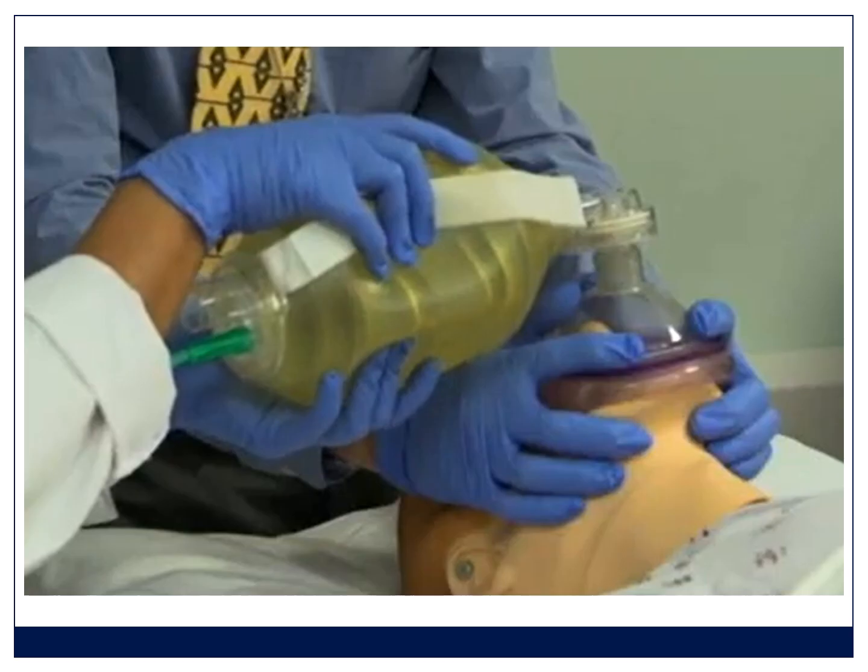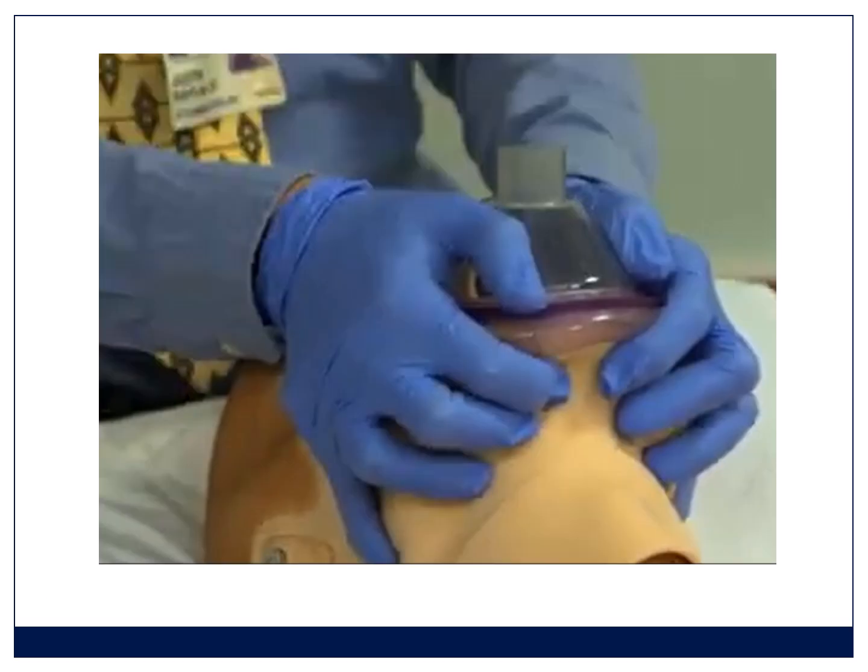Now, difficult mask ventilation by definition needs 2 operators. So the one operator is squeezing the bag and the other one has got that jaw and is lifting that jaw up. And again, this technique that's shown here is not very effective for lifting that jaw. You can see now we're slightly more effective. Those little fingers are underneath the angle of the jaw. And you'll find in most patients you can get the jaw up in this technique. It's still not my favorite.